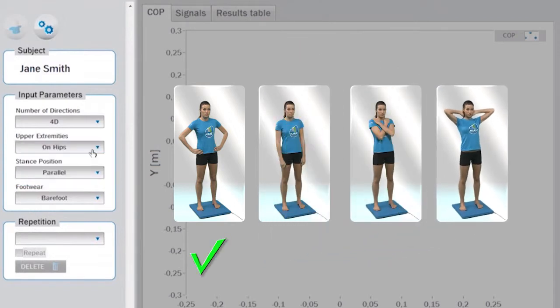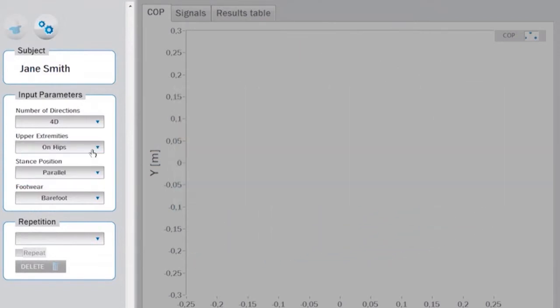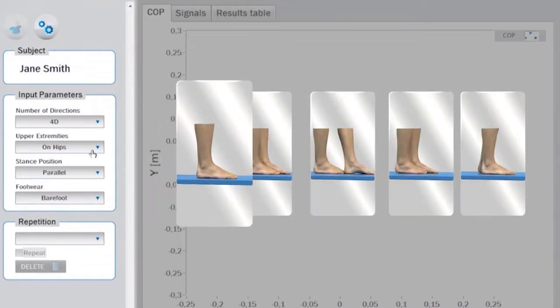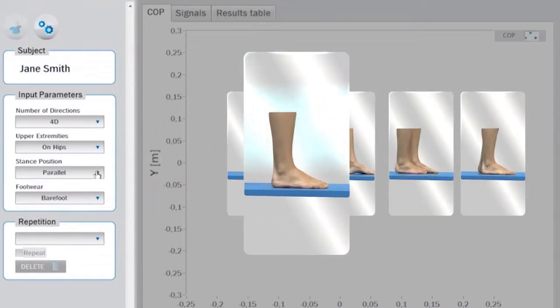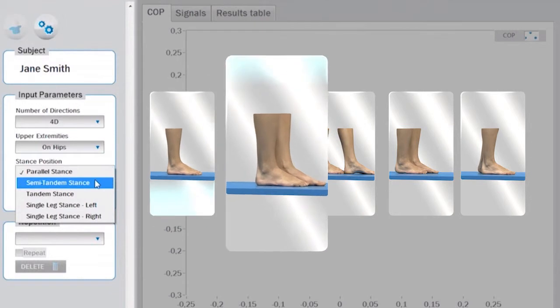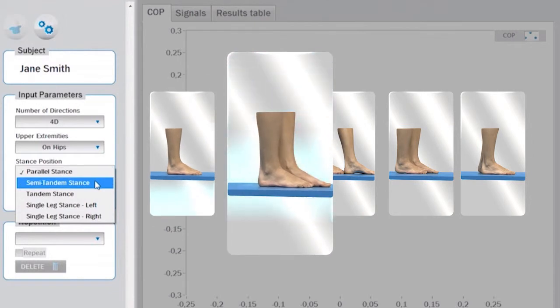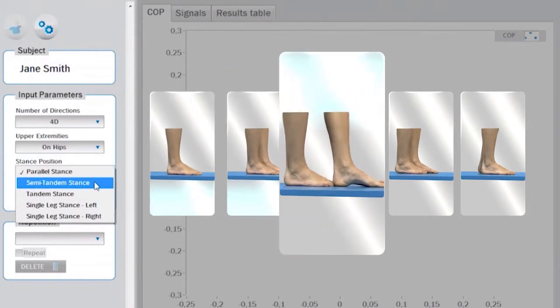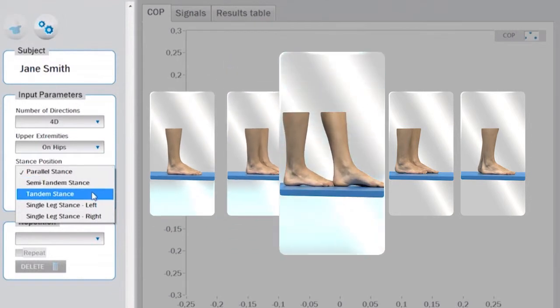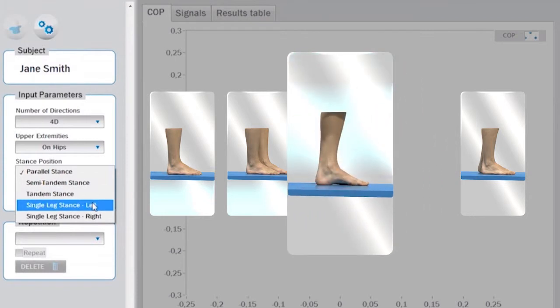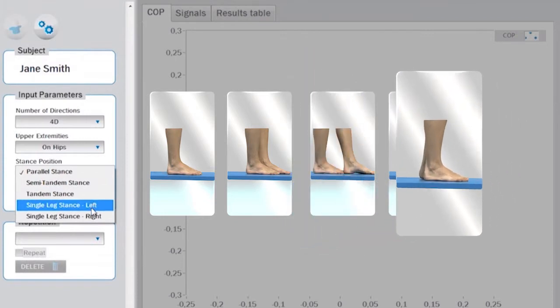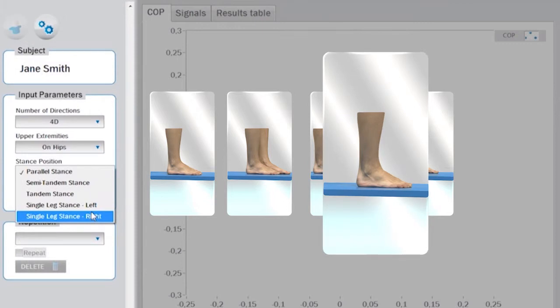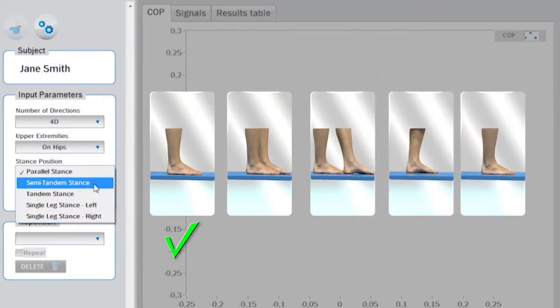Afterwards, determine the stance position, where you can choose among parallel stance, semi-tandem stance, tandem stance, single leg stance on the left leg, or single leg stance on the right leg.